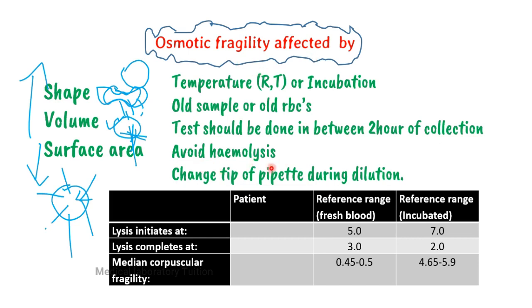Avoiding hemolysis is very important — avoid using needles that are very pointed and do not vigorously mix blood with the anticoagulant, as this causes hemolysis which affects test results because the hemoglobin released absorbs light and gives false readings. During dilution from 0.9 to 0.8 to 0.75 and so on, change the pipette tip each time to avoid dilution errors. The topic is now complete. One question for you: if you listened carefully, in which condition or entity would we take blood for the osmotic fragility test?